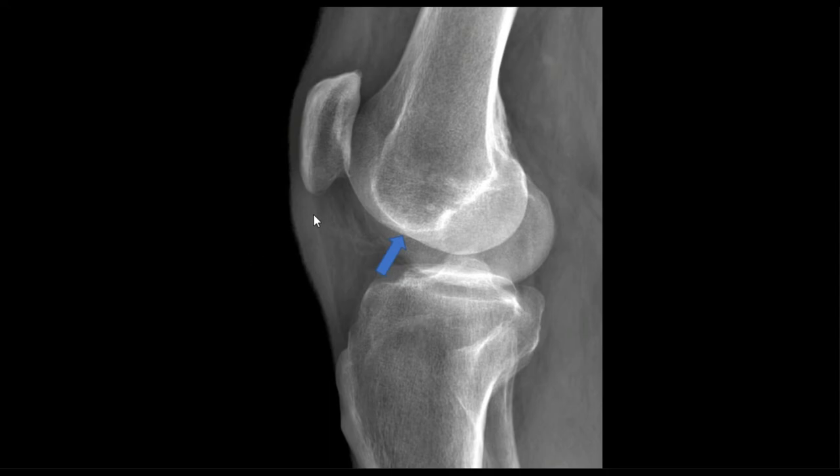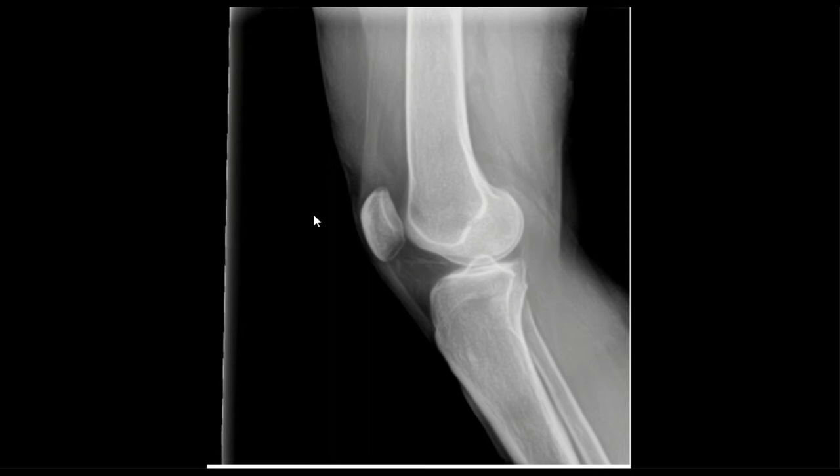Next one — go. If you guessed it was too medially rotated, then you are correct again. We know it needs a little bit of cephalic angle since the medial side is lower than the lateral side on a medial-lateral projection. So we would just angle up a couple more degrees.